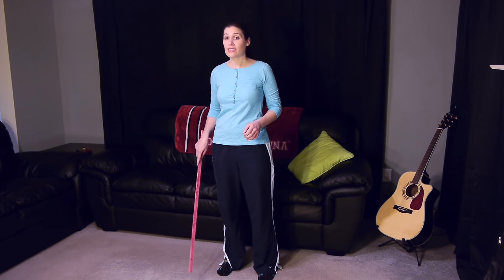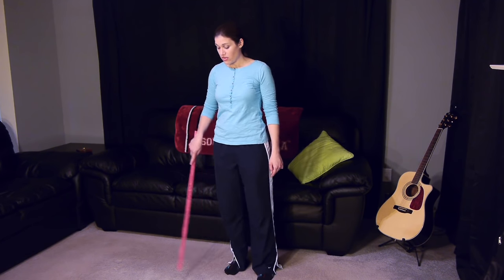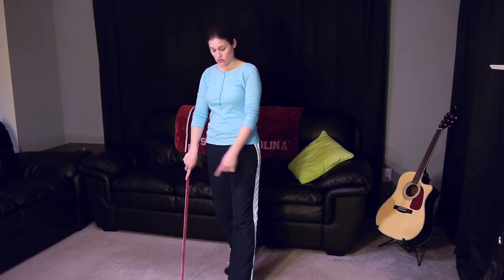The next important piece is what hand to hold the cane in. A lot of those TV show people like to keep the cane on the same side as their injured leg. You actually want to hold it on the opposite side. So if I'm holding it in my right hand, my left leg is the one that needs help. Your cane is going to always follow the injured leg — so if that foot goes forward, the cane goes forward; if it's back behind, the cane is behind.